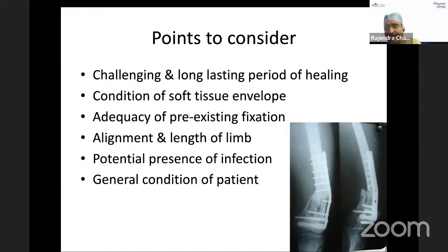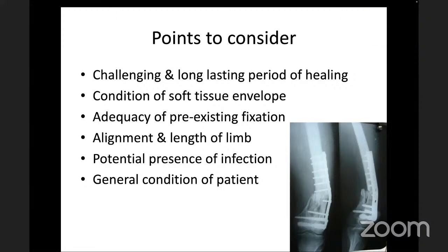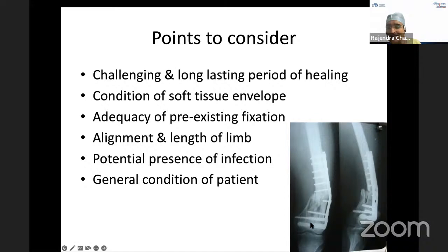Yes, agreed. And just remember, this presentation was prepared in 2003, so it's a long back presentation. At that time, this also gives glimpses of fixation in that era, and as you can see, DCS is the implant which nowadays almost has been given up. So the problems of that implant we can know. And in those days, long spanning was not considered very important.